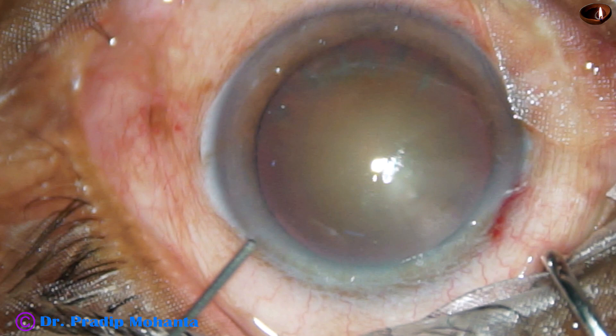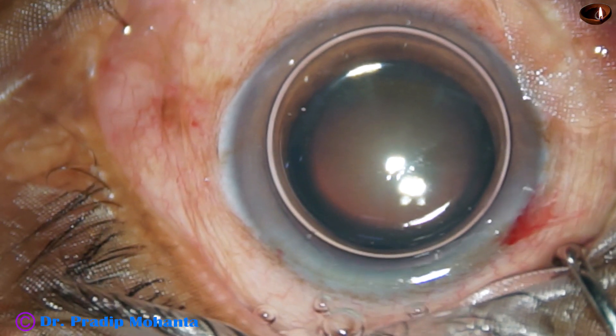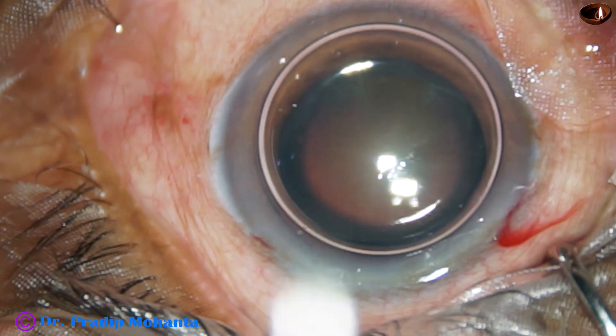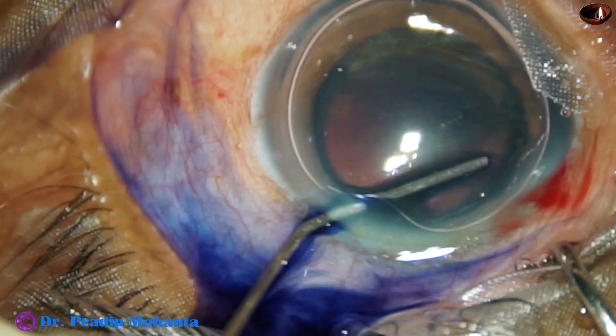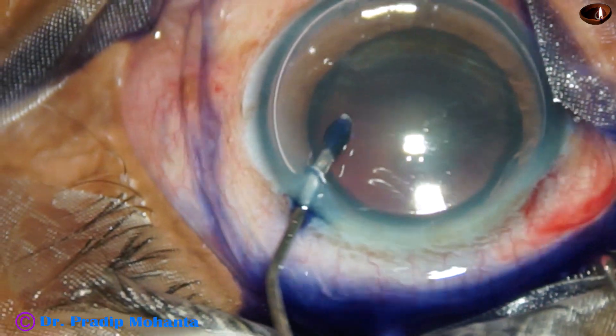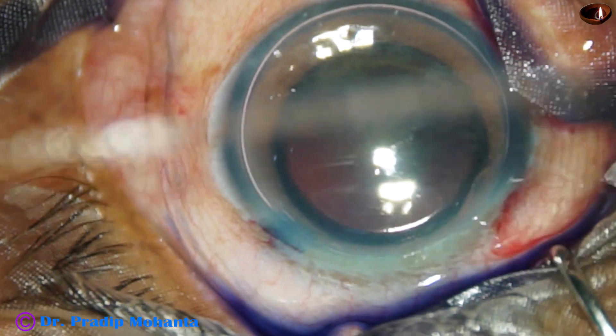By this time, the main incision and side port has been made. An air bubble has been injected into the anterior chamber. Trypan blue dye is then applied over the anterior capsule, taking care that the dye should uniformly stain all around.